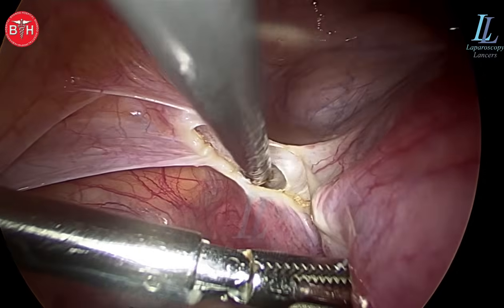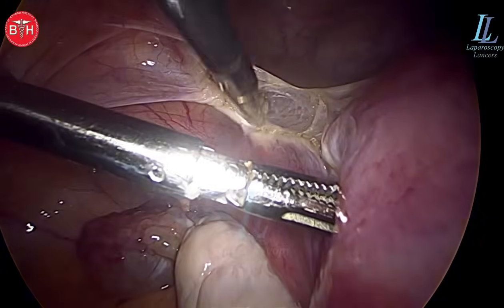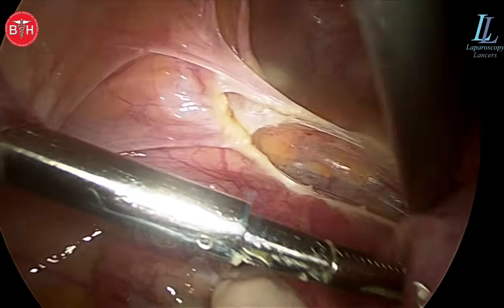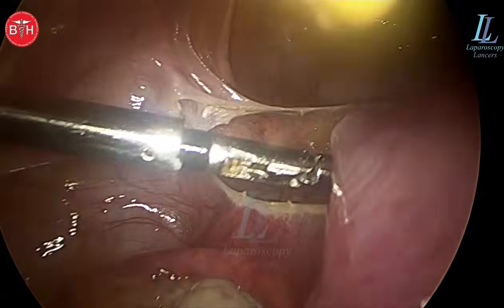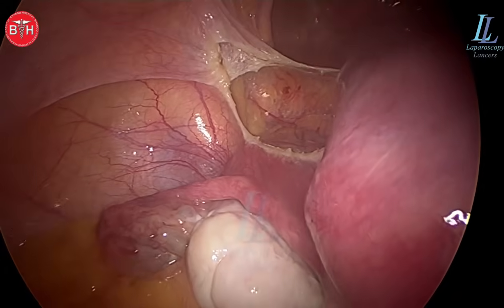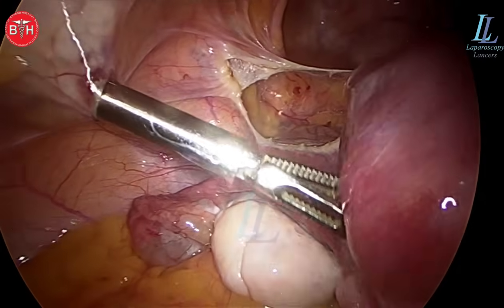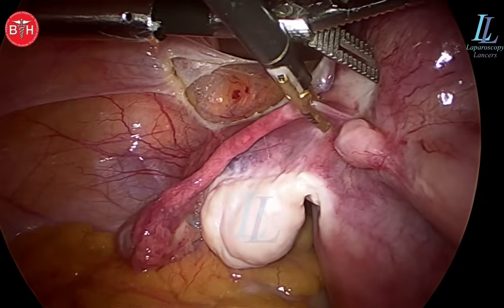The dissection continues using only bipolar shearers, and that's the best instrument for a fast-track surgery. Please learn this surgery, join our course and I'll be teaching you how to do it step by step — and there lies the surprise in the last two minutes of this surgery. Please watch the video carefully, or you can even skip to the end to watch the surprise. The dessert is at the end.